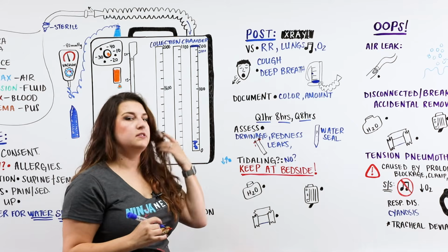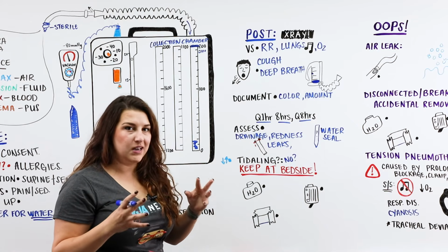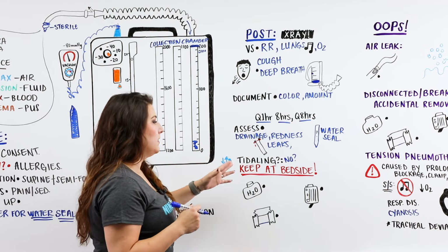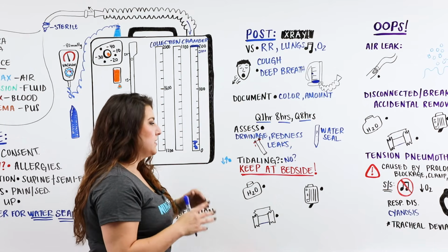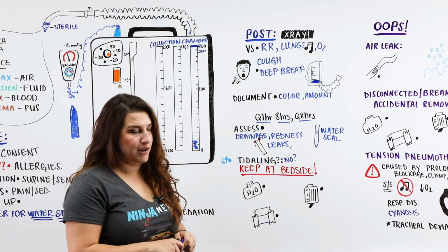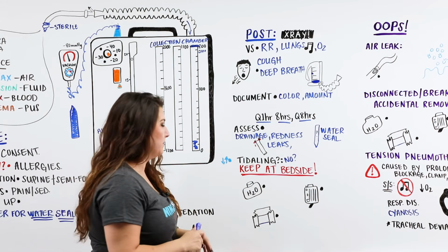If the tidaling has stopped, that means our lung has expanded, and that means that we don't need a chest tube anymore. So if you walked in and you're like, yo, tidaling's not going, let me make sure you tap on the little spot where the ball is, make sure the ball's not just stuck there, and you see that tidaling has stopped, then you know, hey, I should probably contact the provider, get a chest x-ray, because we can probably take this chest tube out today, which the patient is always excited about.